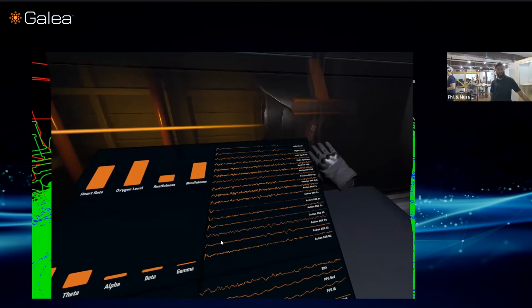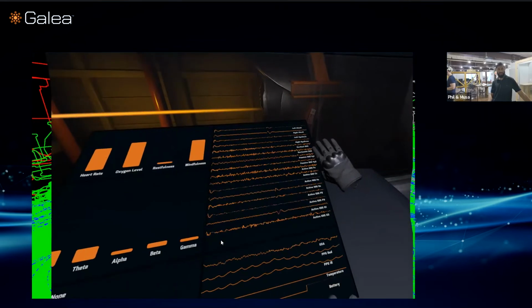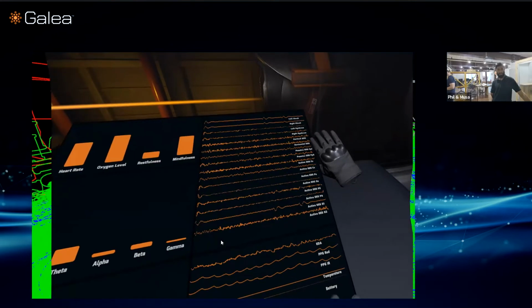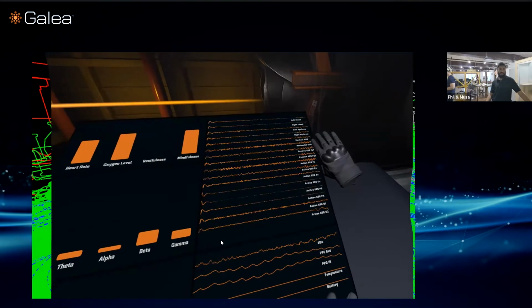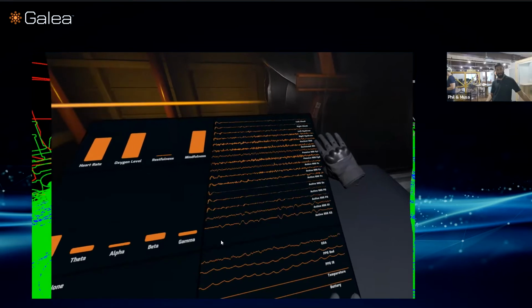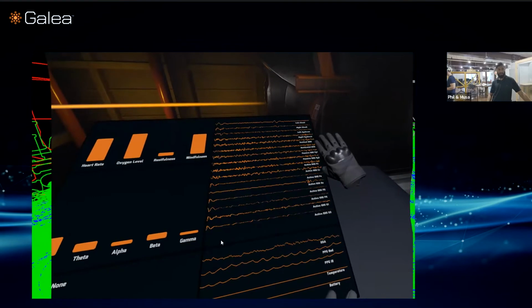So below the 4 EMG channels, we have vertical and horizontal EOG. So EOG stands for electrooculogram, and it measures the movement of the eye, and the eye can be visualized as a dipole. So when the eye moves, there are large fluctuations in the vertical and horizontal directions, and that can provide us with information like saccades. And that gives us a quantifiable metric along with what we already get from the Varjo eye tracker, which gives you a direction vector and a movement vector.